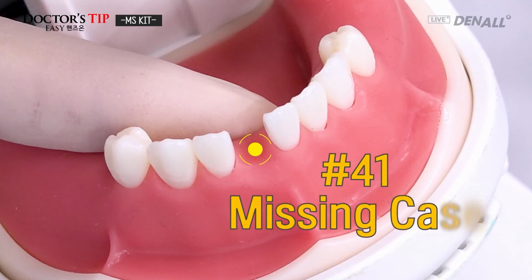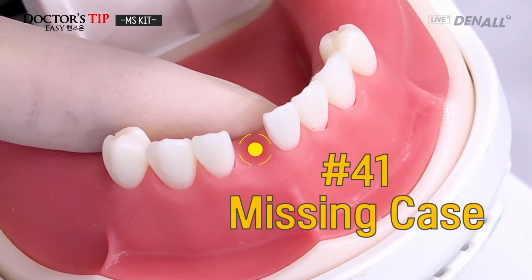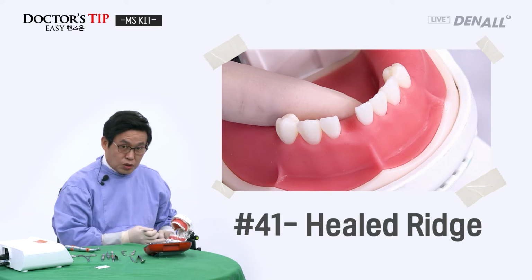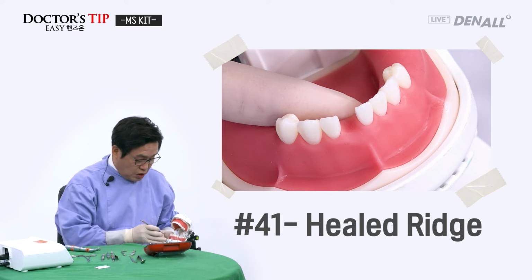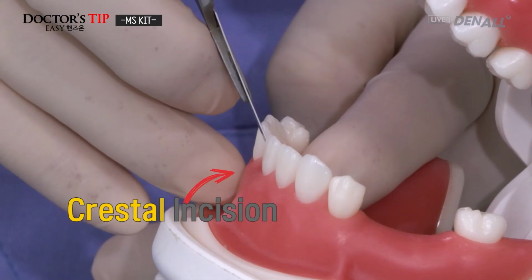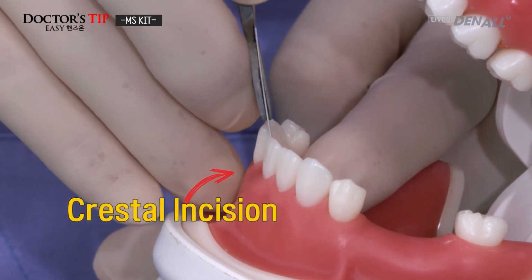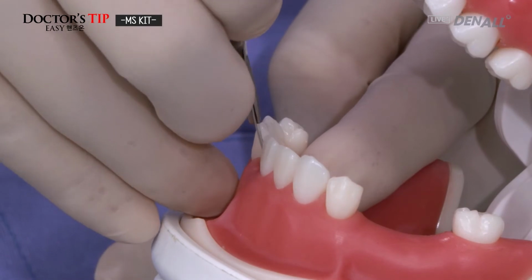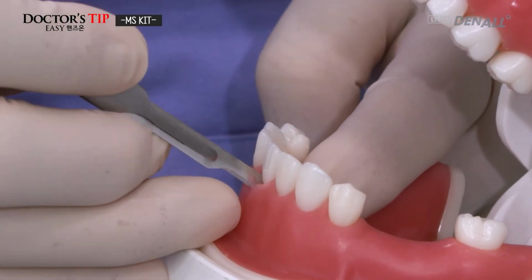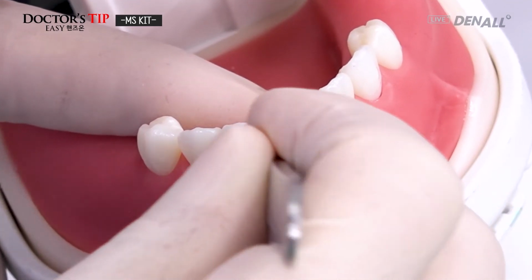41 is missing, and a 2.5, length 11 millimeter MS will be placed first in the missing area. It's been a while since the tooth was taken out, so it's a healed ridge. So I'll do a crestal incision toward the lingual side. To the adjacent teeth, I will release and open the flap.